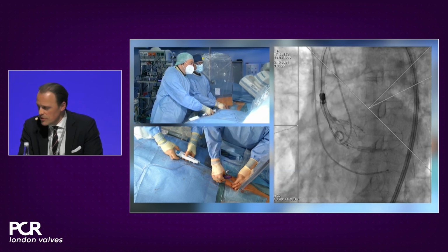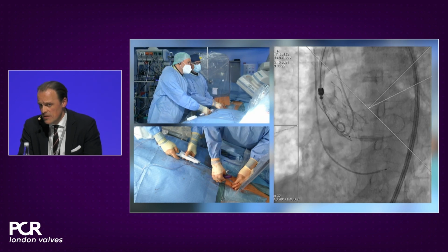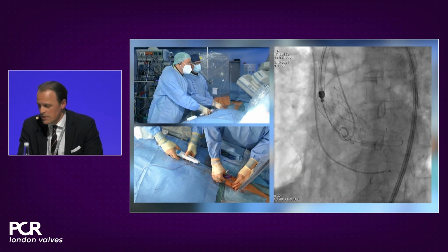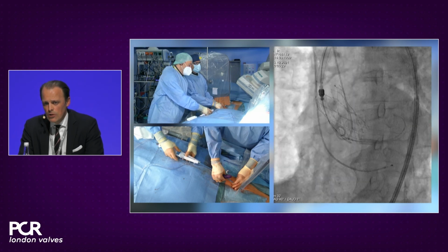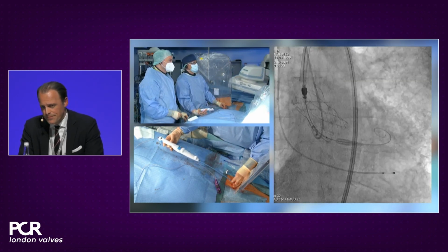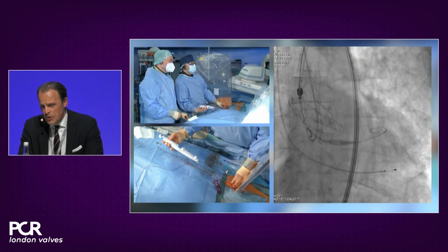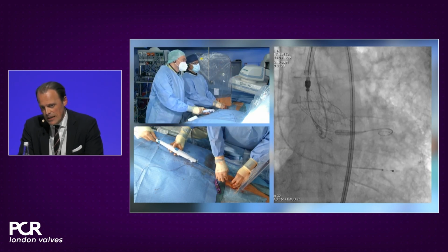Again, there's absolutely no need to rush it because there is no hemodynamic compromise, such as you might see in a self-expandable supra-annular valve. And once the valve has left the capsule, look out for the markers in the outflow that you're really free of the implant catheter. And that's basically it.